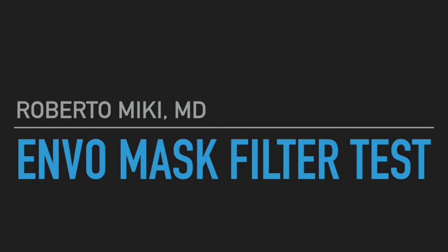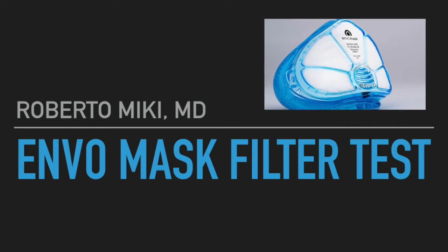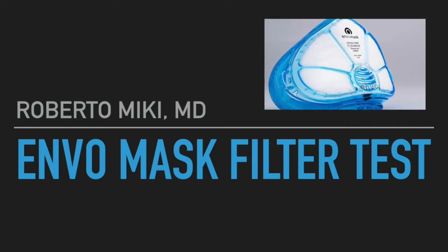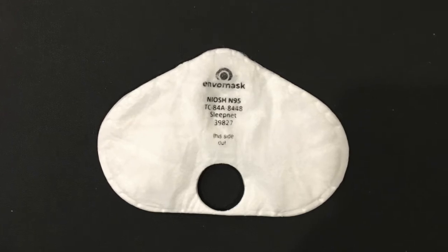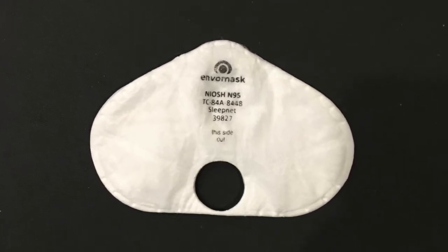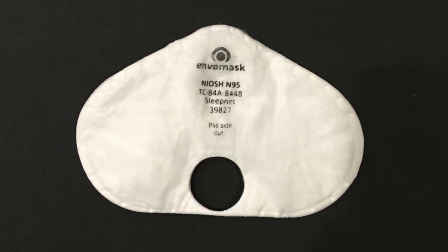Hi, it's Roberto Mickey, and we're going to be showing some results from the tests that we performed on the Envo mask. This mask has become very popular amongst some of the anesthesiologists in town. So I tried to test the mask itself with the filter, but we were unable to get a good seal on the mannequin head.